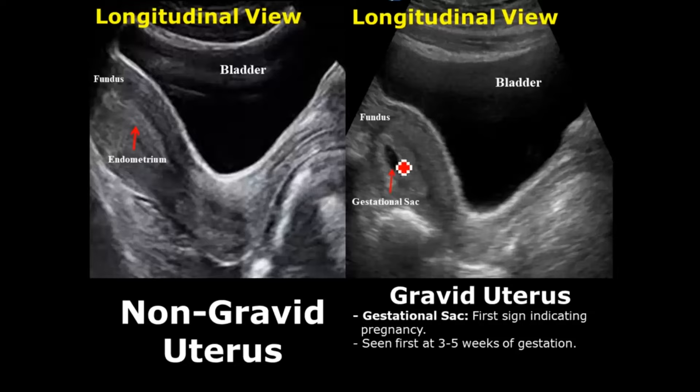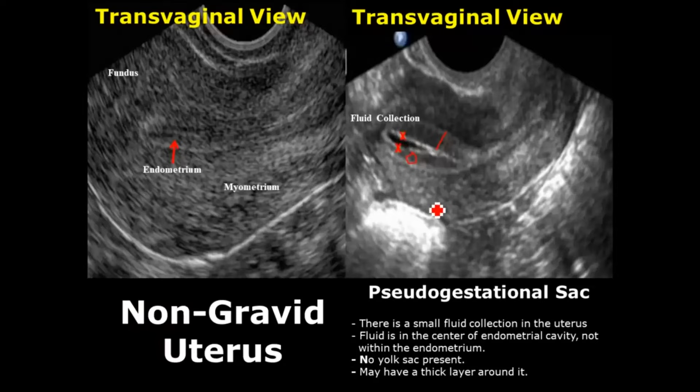On the right side is the gravid uterus with a gestational sac. This gestational sac is usually visualized at 3 to 5 weeks of gestational age. A pseudogestational sac is a fluid collection in the uterus which can mimic a real gestational sac — the main differentiating feature is that it is located centrally in the endometrial cavity rather than being implanted in the endometrium, and sometimes it may be surrounded by a thick decidual layer.